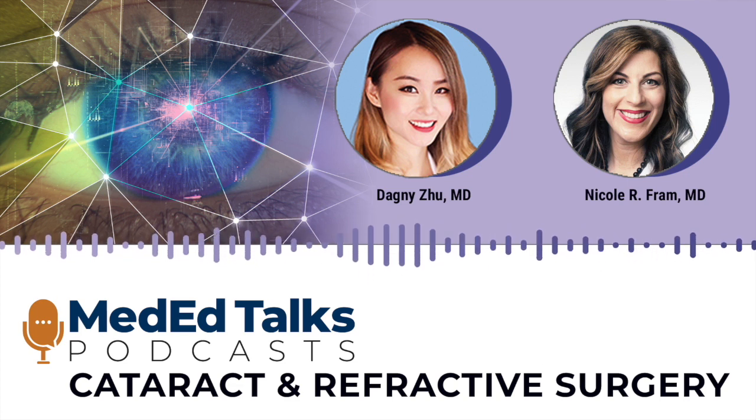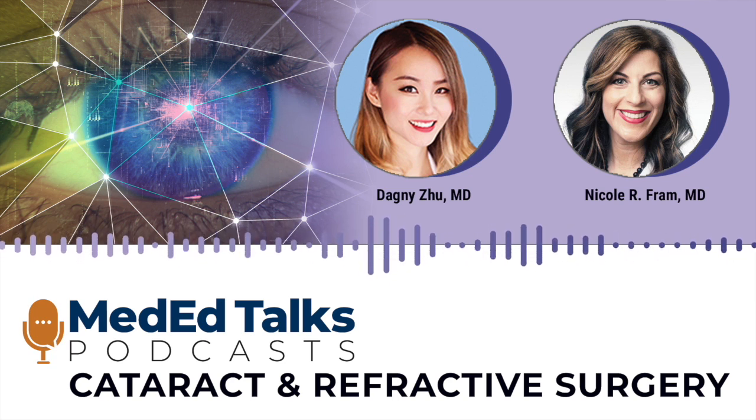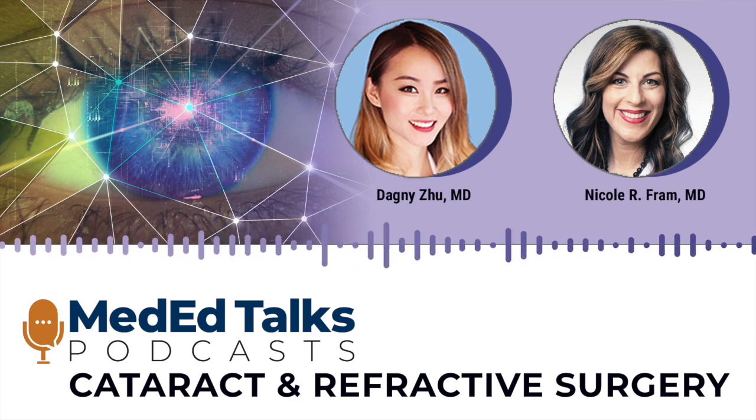If you're doing complex surgery and doing intrascleral haptic fixation, being able to tell on the table if there's significant tilt, I think will help a lot of patients in the future with potential for UGH syndrome or inflammation and pigment dispersion. And then lastly, I've used intraoperative OCT during corneal surgery.